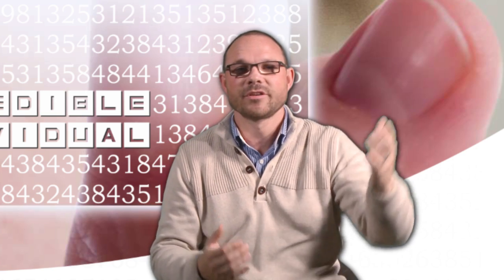So the second example I want to give you is the optometrist sitting in his test room. He's producing a script with a patient in front of him, and this patient is looking through either a trial frame or the phoropter head. Now, both of those usually are perfectly vertical, perfectly straight in front of the patient, with a very close working distance to the eye. The optometrist generates this script. The patient walks out into the front of the practice and now selects his frame.